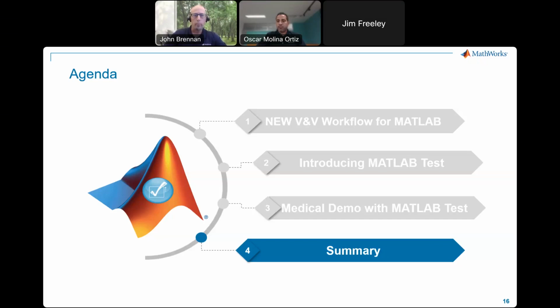Sure thing. Let me share my screen here. All right. So thank you very much, Oscar. That was pretty interesting stuff. One of the questions that came in while I'm working towards the summary is, is this demo available to customers? We can make it available to customers, absolutely. Okay, fantastic. Thank you. So let me summarize here.